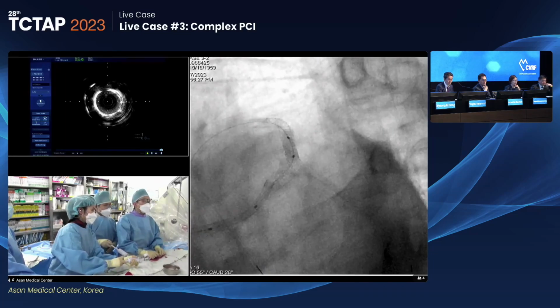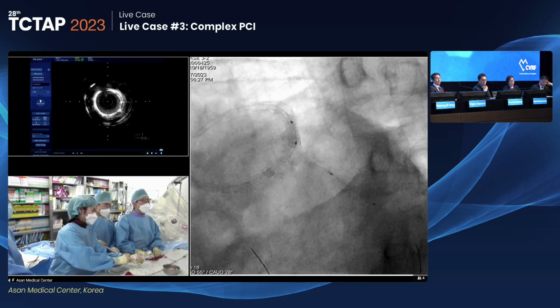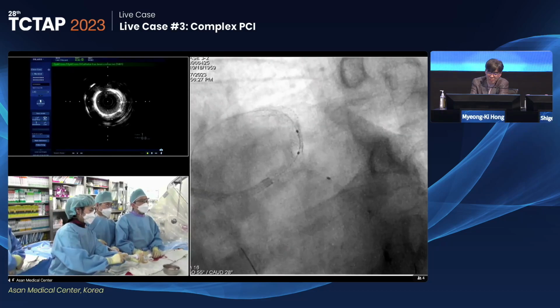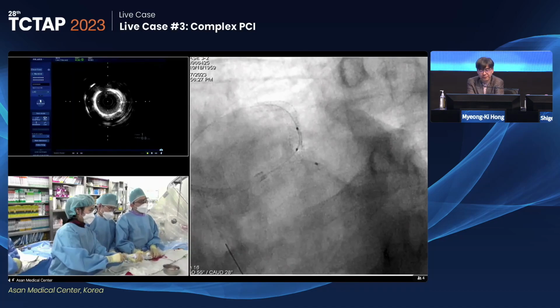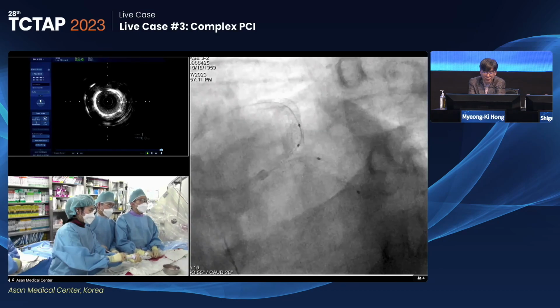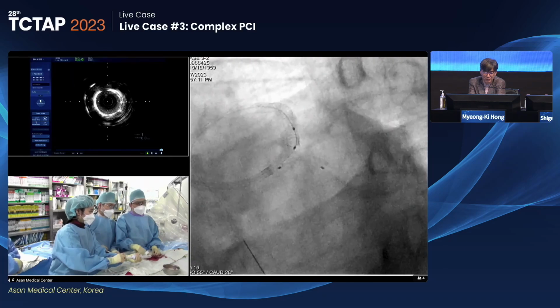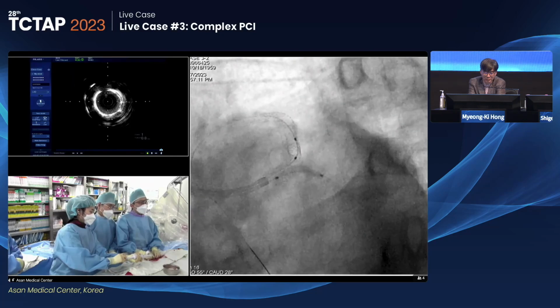And this is the NC balloon. Okay, easily passes now. Deflation. Okay. Nominal? Nominal. 12. I will open the distal region also. Deflation. And the most important thing is to open the proximal calcification. 20. 24.